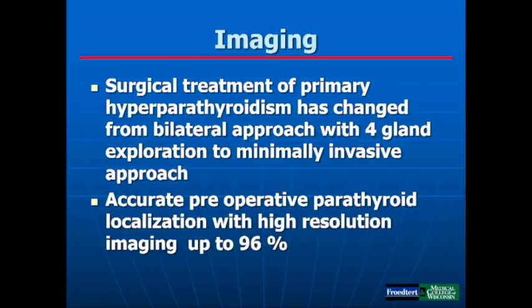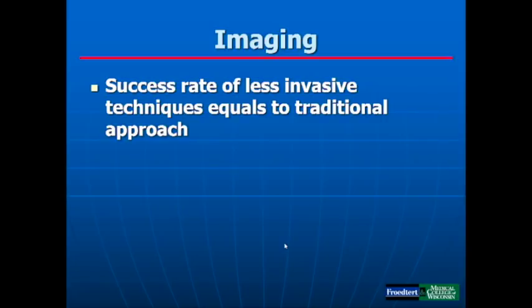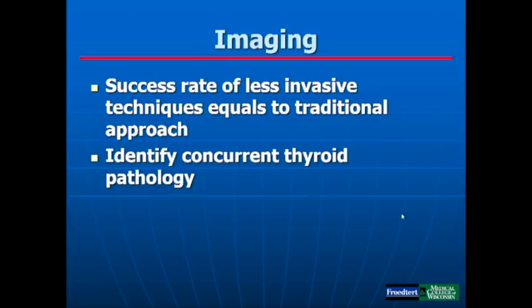And this is important because with current imaging, the preoperative localization of parathyroid gland with high resolution has a great sensitivity, up to about 96% of localization of these structures. It is considered that the success rate of less invasive techniques equals the traditional approach.